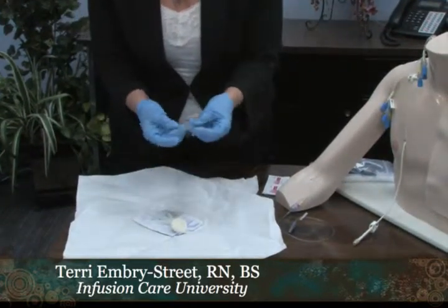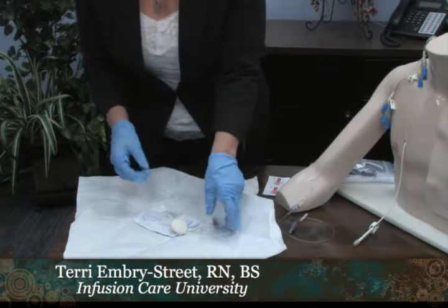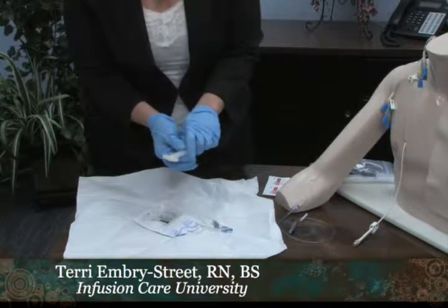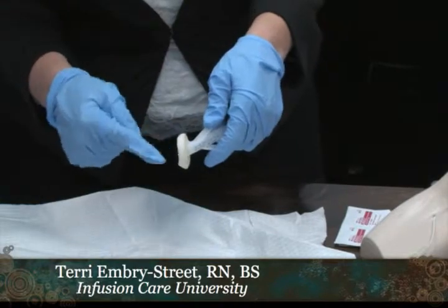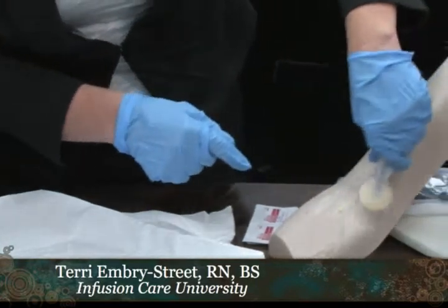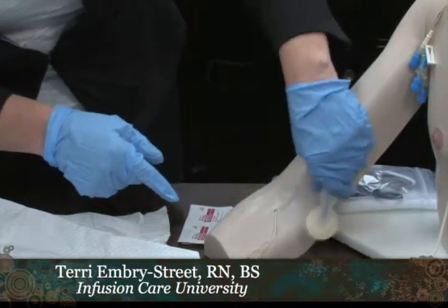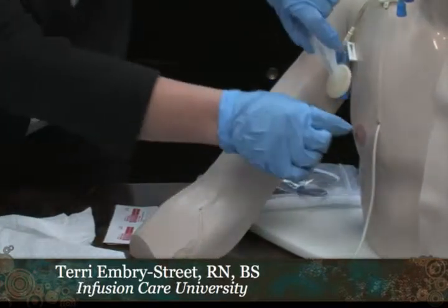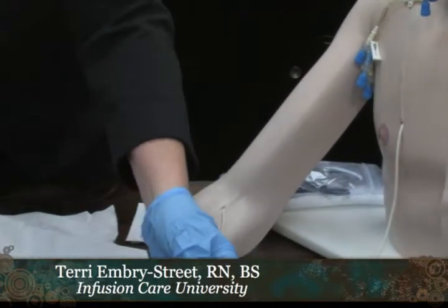I'm not going to prime this yet — I'll wait until my dressing is on, because I can't connect a non-sterile syringe to this while it's in my field. Chlorhexidine is the prep that we provide and is preferred by the CDC. To activate it, you pop it, which allows the fluid to reach the end. The difference between this and alcohol or iodine is you're able to scrub the area all around, since it's going to clean and disinfect the area. You can get all around the catheter, and on a chest catheter you can even use a gauze to lift up the catheter if needed.